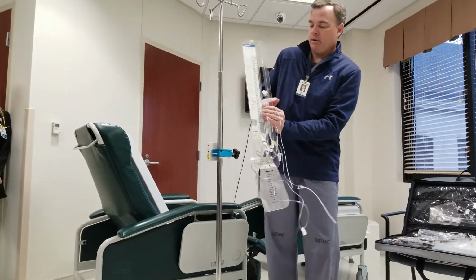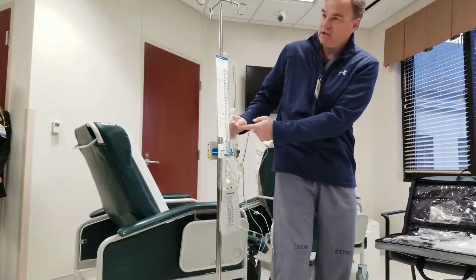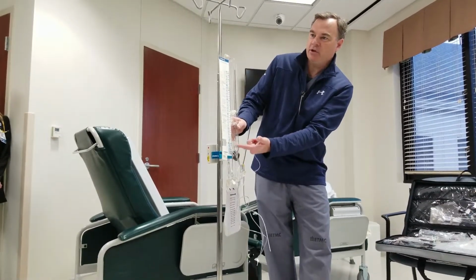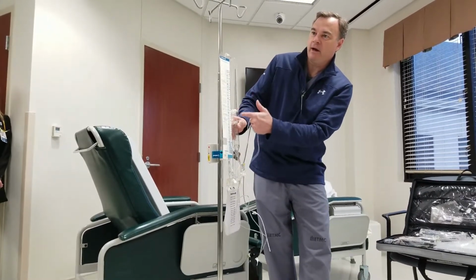And then what's happening here is this is staying in relation to the puncture site. You can see this chamber, if I were laying perfectly horizontal, is just a little bit taller. And that gravity push, just the spatial relations there, is what actually determines the flow rate.